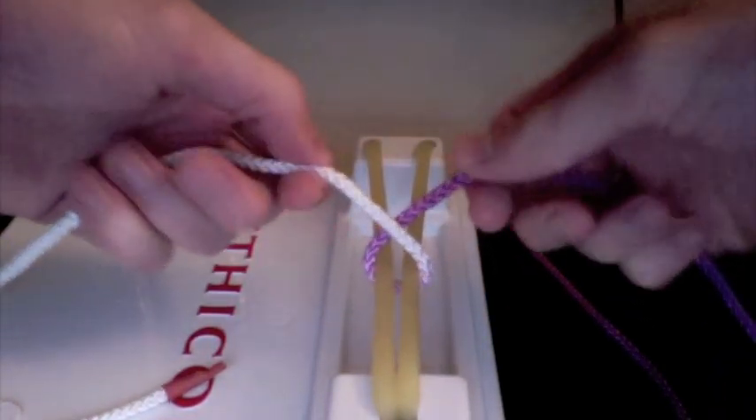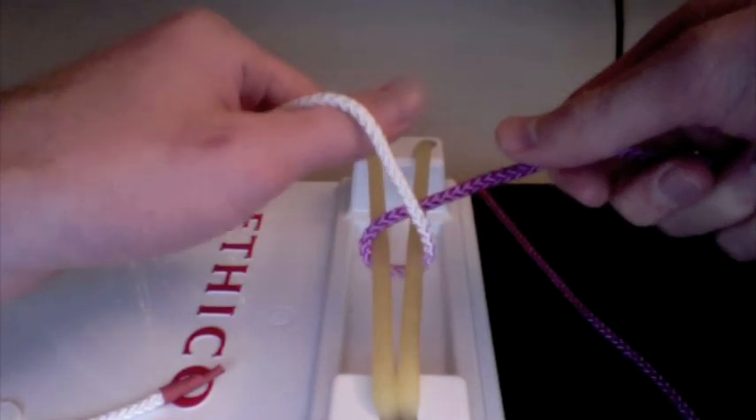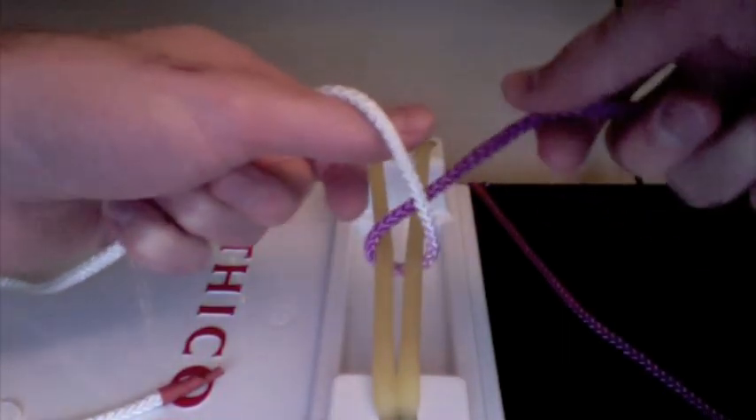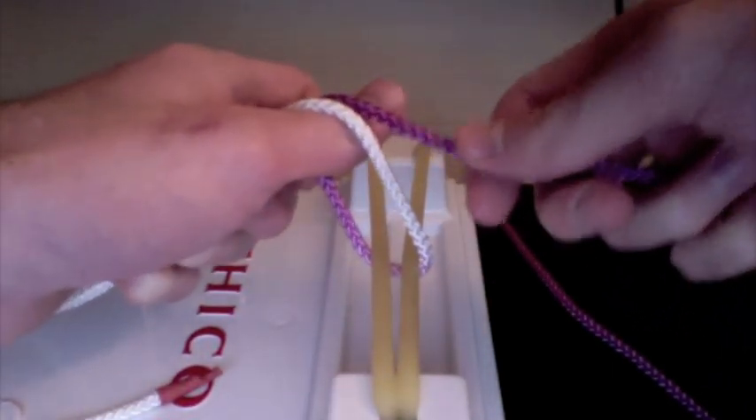The first thing you're going to do for the first move is make a nice little loop of the white strand over your thumb. You always want the purple and white strands to be going opposite directions, so in this case the purple strand is going to go over to the right.